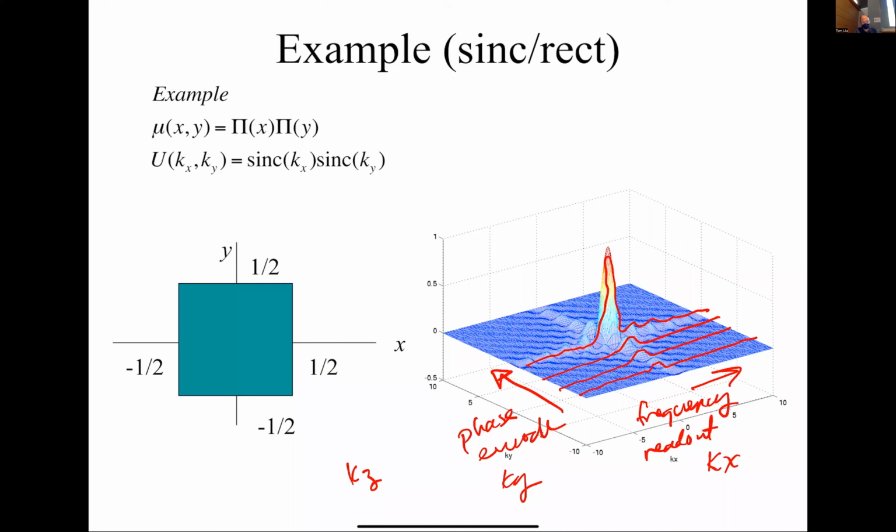Okay. Now we don't actually have to. I mean, there are trajectories where we don't want to do this stepping, and so the other thing we could imagine doing is we can acquire the data, like we could start at the center and just spiral out and collect the data like that. So we could imagine collecting the data like this. Okay. So we just go very quickly.